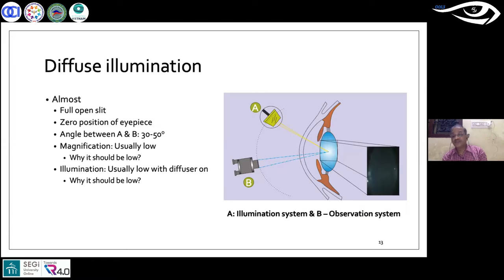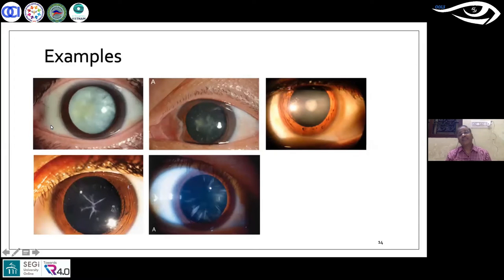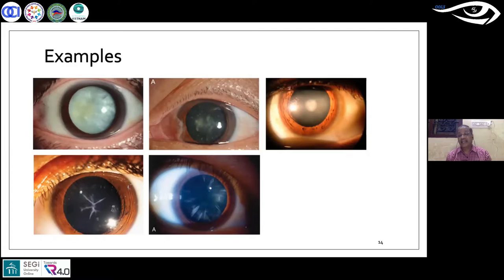In diffuse illumination, there is no focused illumination on a particular area — you can see the entire eye generally. The illumination is diffuse and magnification is low, allowing you to see the whole eye and different types of cataract.